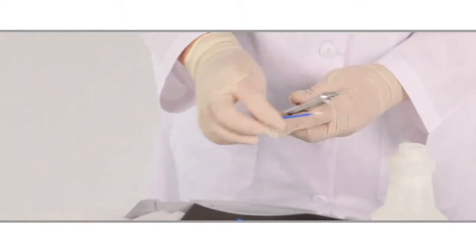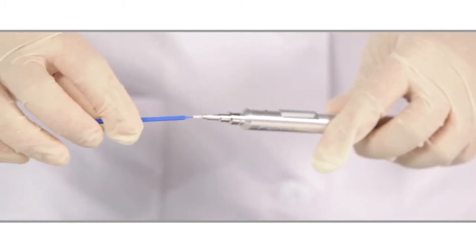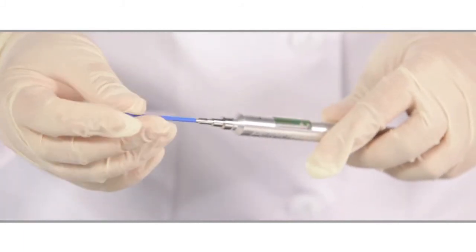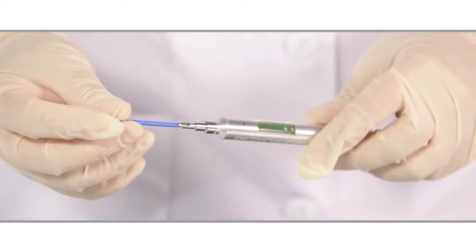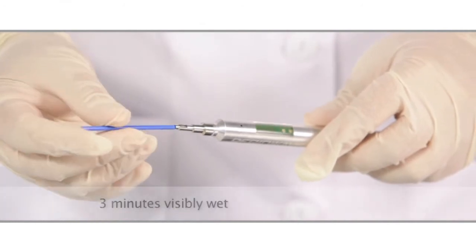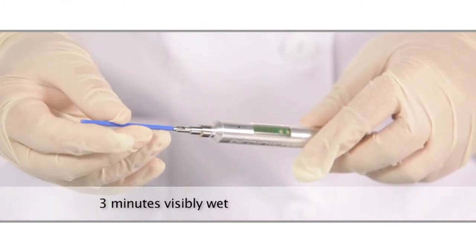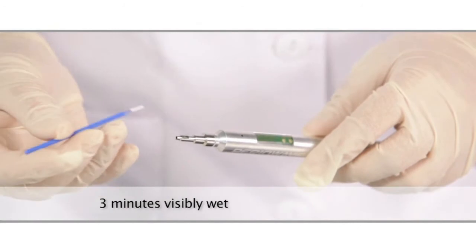Dip the optical cleaning swab into the Cavicide and insert the cleaning swab directly into the tube. Rotate the swab to cover the entire surface area of the lens and tube. Allow the surfaces to remain visibly wet for at least three minutes.